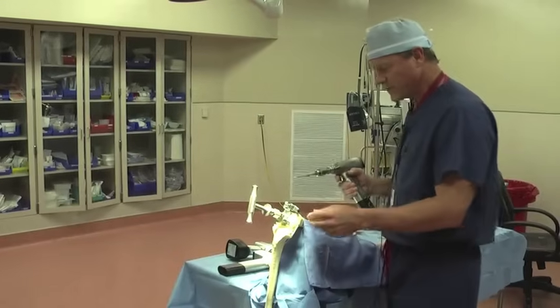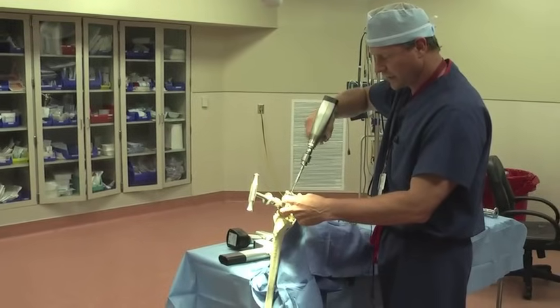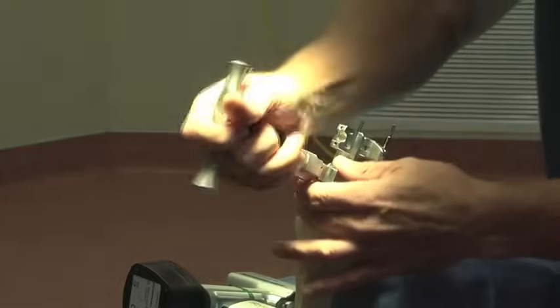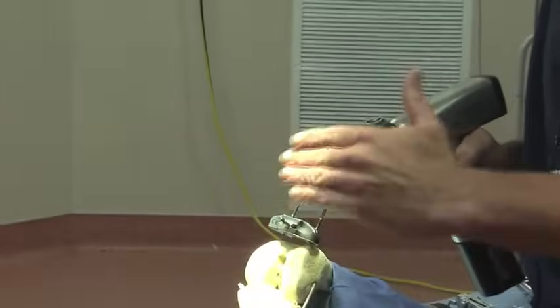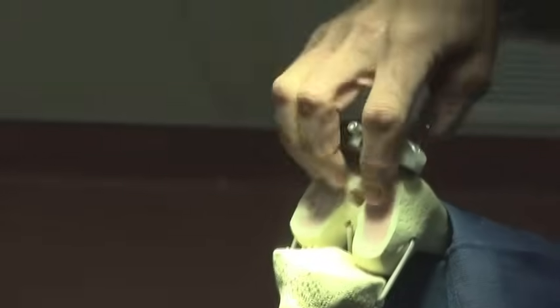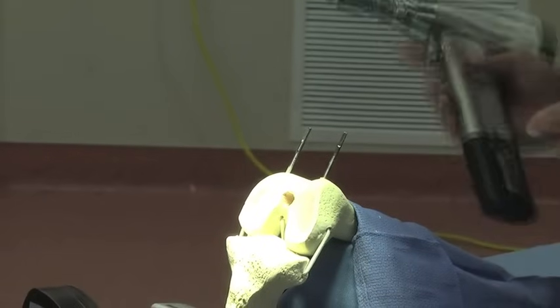Next we'll move to this side of the table and actually pin this little block into place. We'll place it down and put a second pin in for good stability. Then we'll release and pull the alignment rod off. If we like our distance, we can adjust this — if we don't feel we're getting enough bone off, need more bone, or want to correct the angle, we can do that at this point. Once that cut is made nice and flat and smooth, we'll remove our pins.